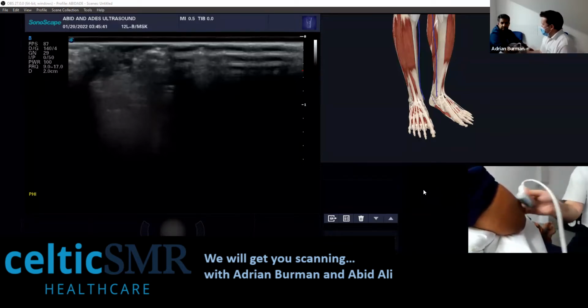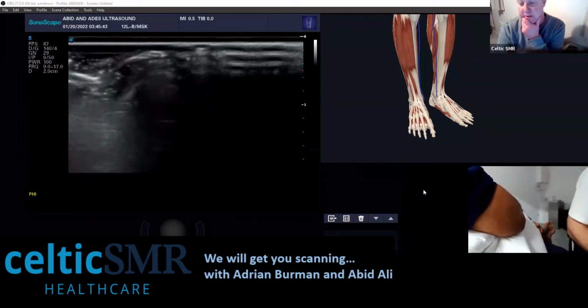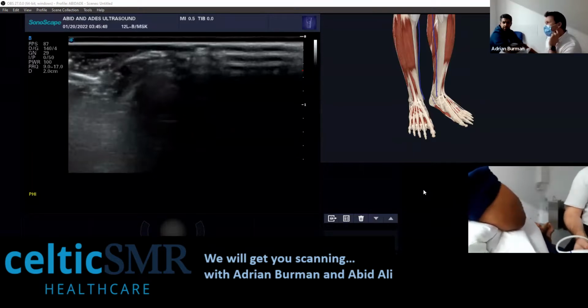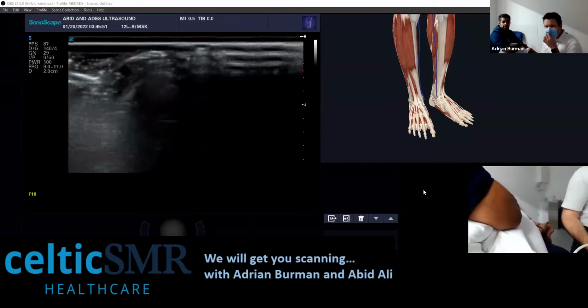Nice question there. Would reporting a percentage in partial thickness tears be useful? Probably. I don't personally, though there may be some people that do. I would probably just give the measurement.